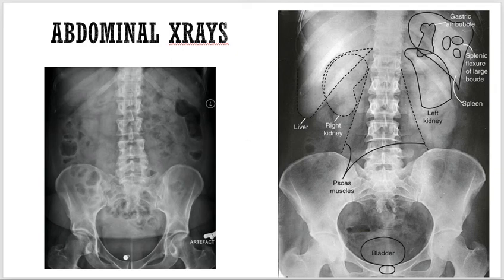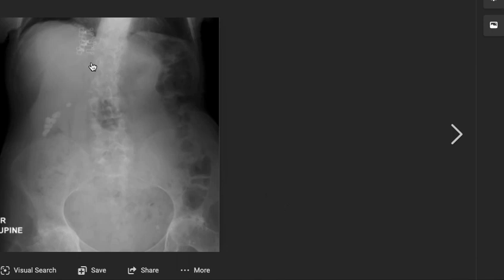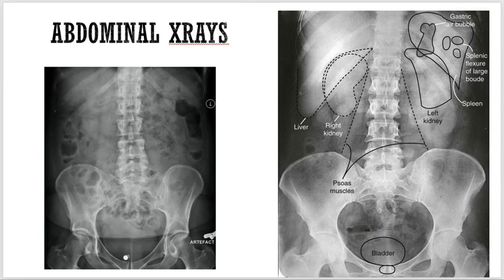For example, what is this? See, these are some clips. Maybe this one is her dress. Okay, because if she has gallstones, for sure she's a female. Not for sure, like males also do have, but females have more. So maybe she's wearing a dress, and see, this is the artifact. Okay, so that's all about X-rays, guys. In the next lecture, we will discuss the CT scan.